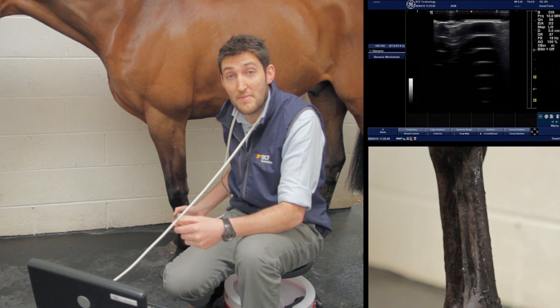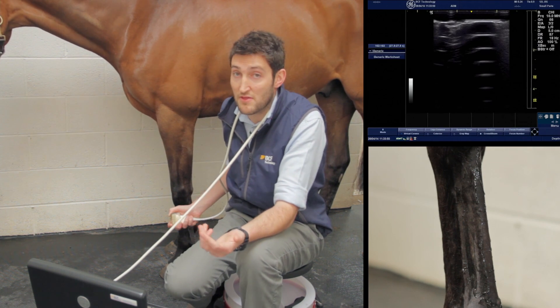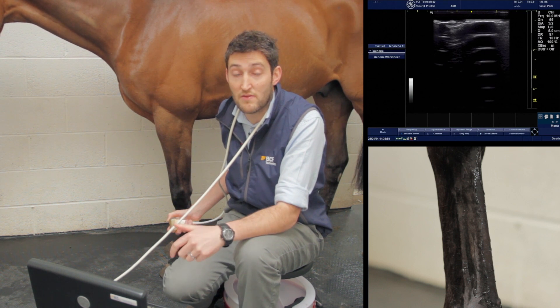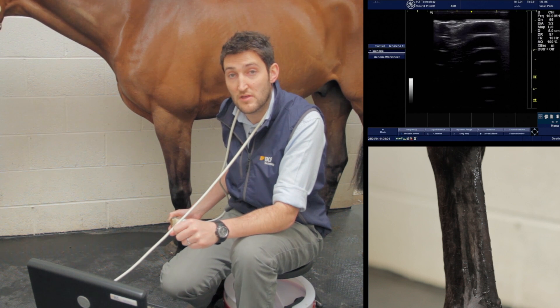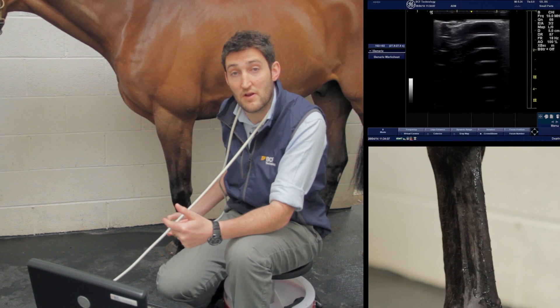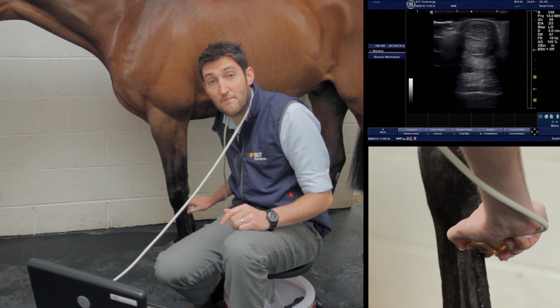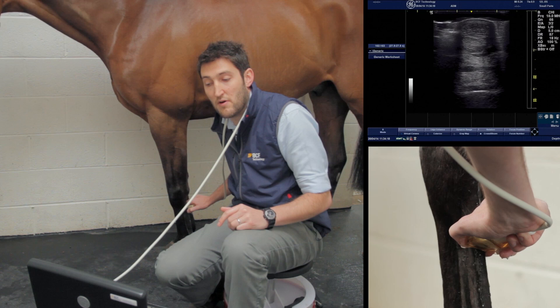We're moving down the leg to the mid-metacarpal region — zones 2a and 2b. There's nothing anatomically distinct about these zones, so the only way we know we're imaging them is by measuring from the accessory carpal bone. Zone 2a is around 7 to 10 centimeters from the accessory carpal, varying slightly depending on the size of the horse — roughly slightly proximal to halfway down the cannon bone. We optimize our image and freeze.